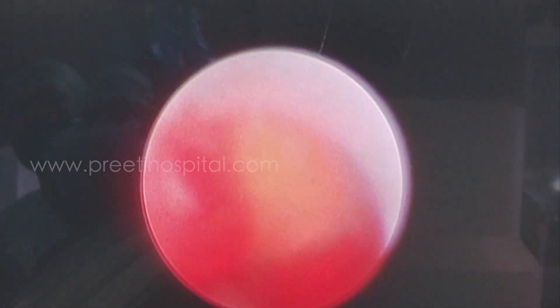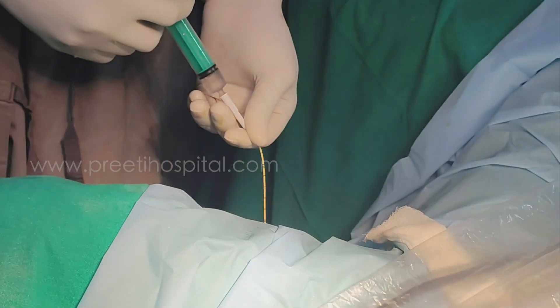The saline is continuously flushing. Now I will do the focusing. Focusing is also important — don't skip focusing and just keep on working.